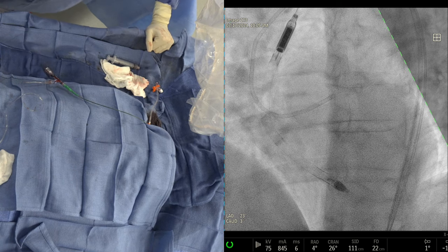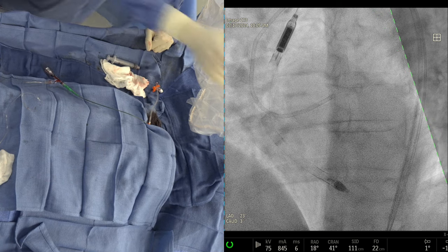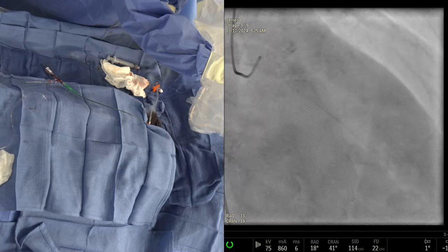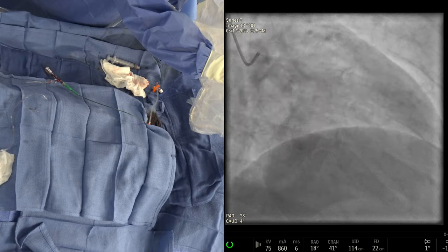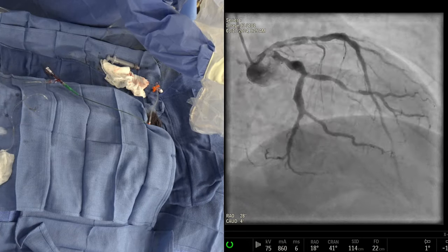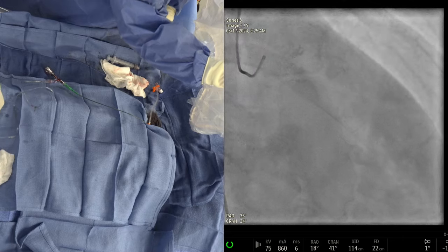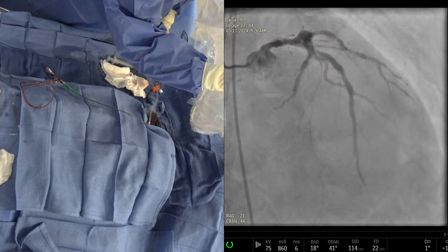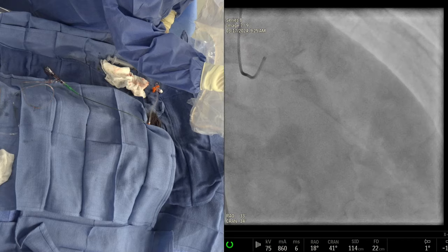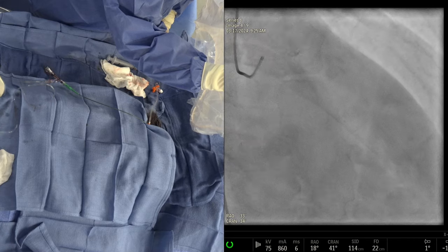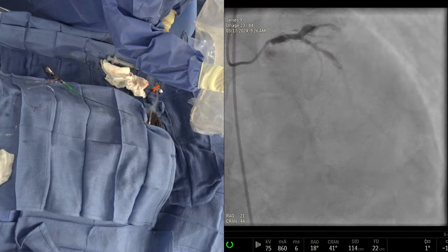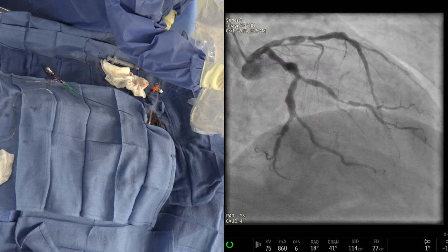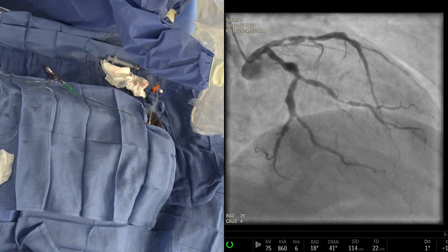This case was a little unusual — the patient came with LV thrombus but then it wasn't there, so we weren't sure if it would qualify. We'll give it a try. There is a little discrepancy of EF between our lab and the core lab — we saw it in earlier cases. Rather than counting our own EF, we'll just try with the core lab, since EF measurement is subjective by one or two percent and the core lab is more uniform.